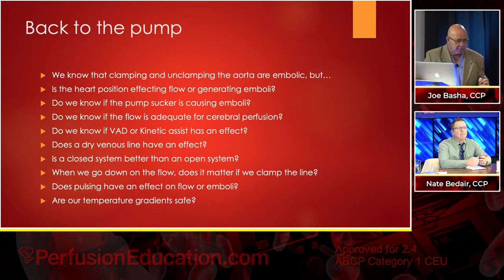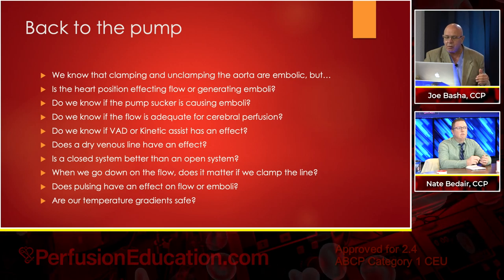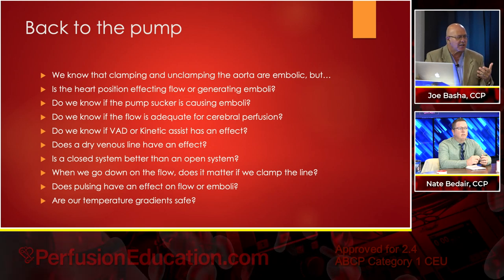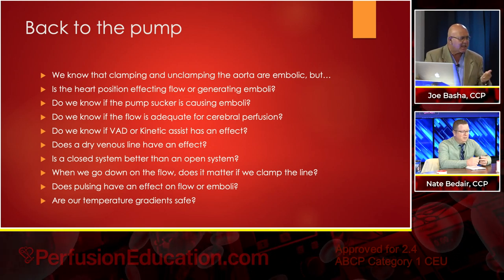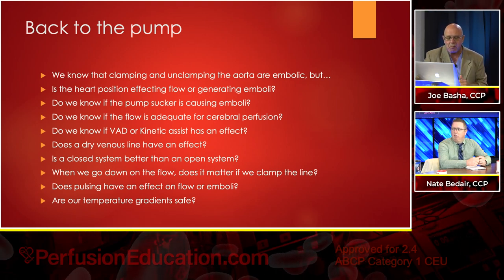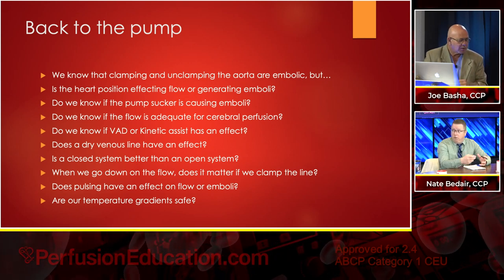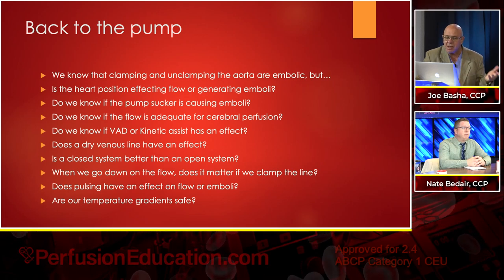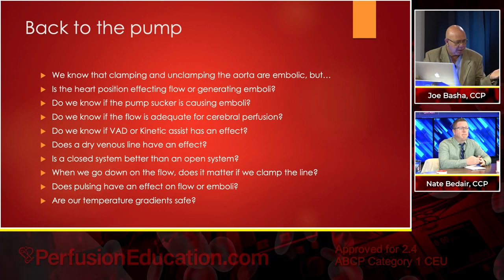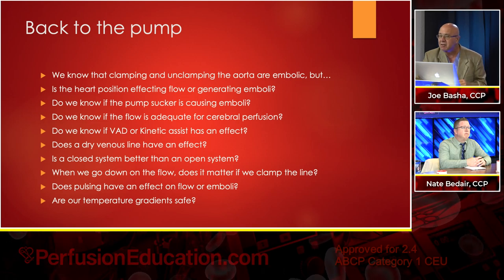Is the heart position effectively affecting the flow or generating emboli? So I think what I'm trying to say there is when they pull the heart over and change the cannula position and it's jetting against the aortic wall, what is that causing? Or if your cannulation site is right next to a plaque that you didn't know was there, because not everybody checks the aorta with the ultrasound. Do we know if the pump sucker is causing emboli? Absolutely. Do we know if the flow is adequate for cerebral perfusion?